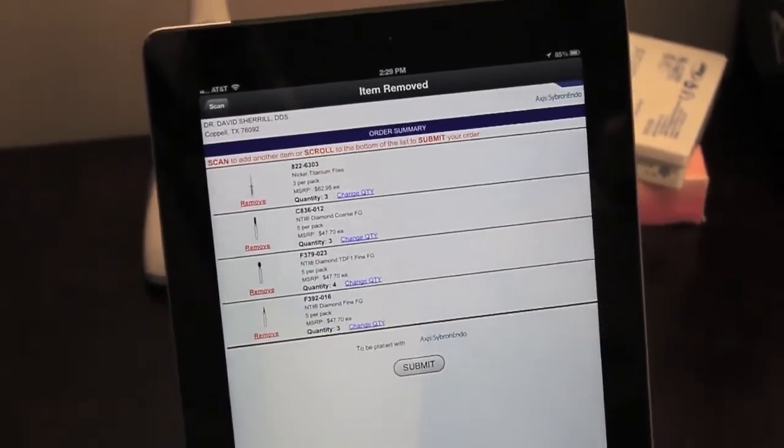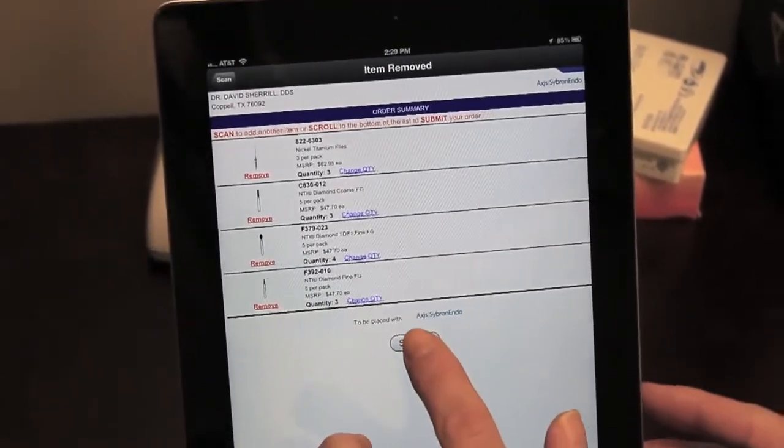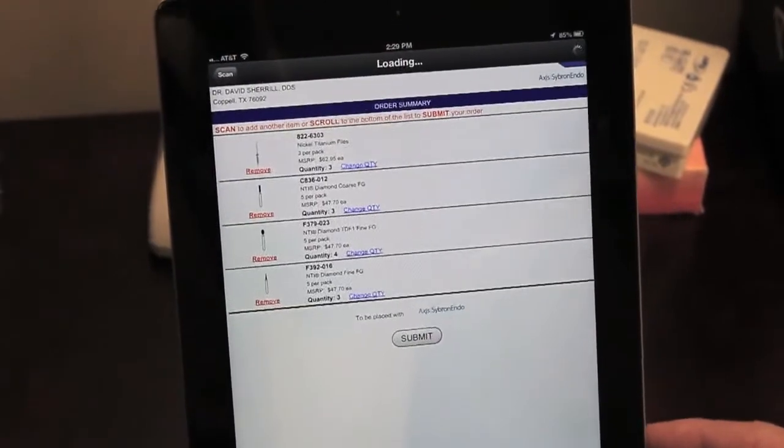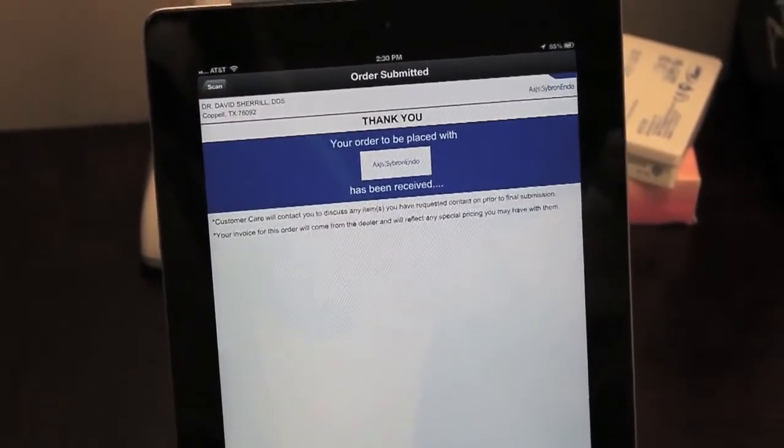Now that our order is ready, I'm going to submit the final order. So I click Submit. That's it. The order's been placed.